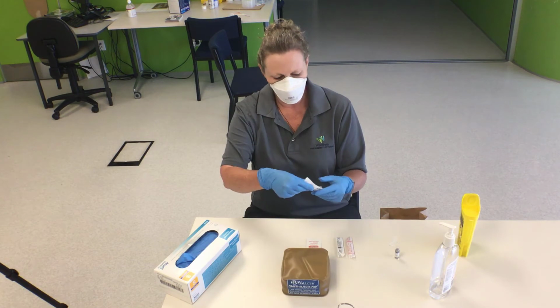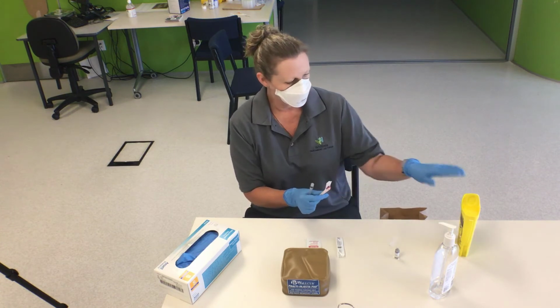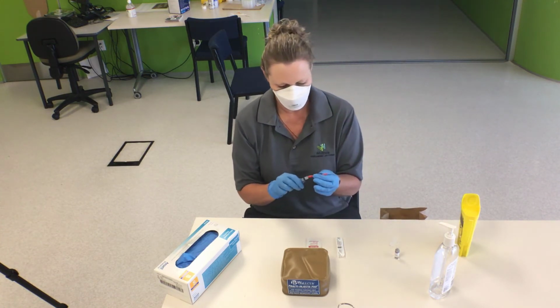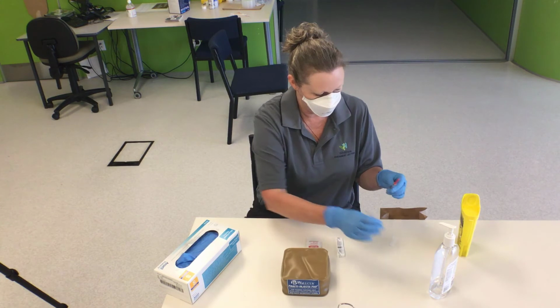I have my 3 mil syringe here and my drawing up needle. Got my sharps available. And I'm just going to pop that on.